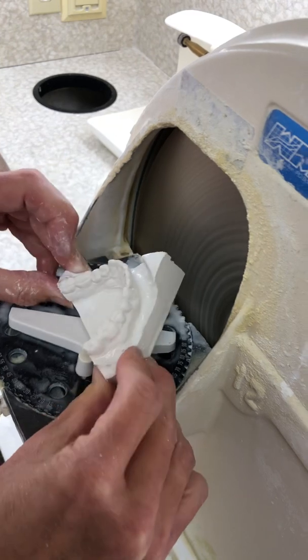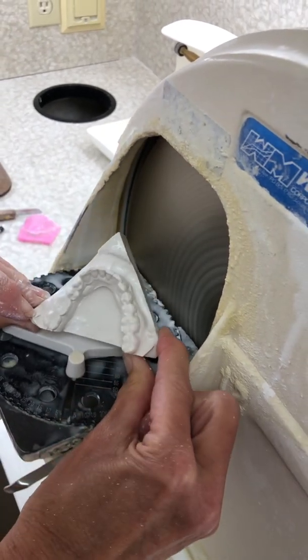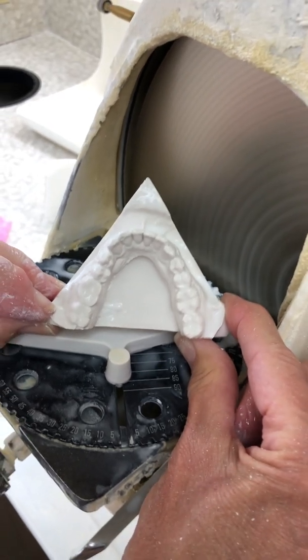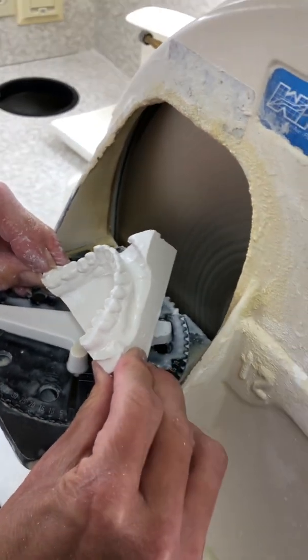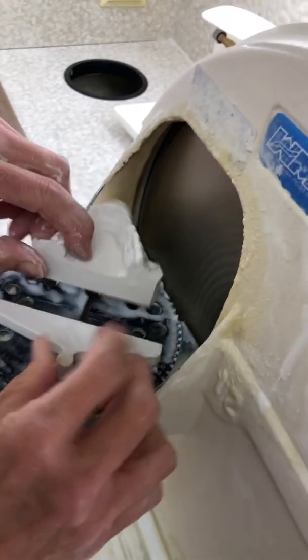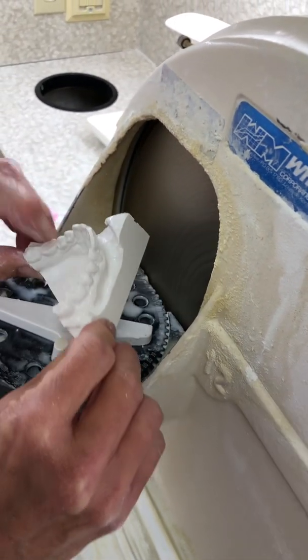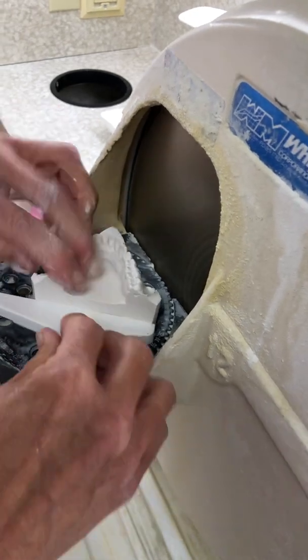Close, stop, and then basically take a look straight on and decide if there's something that one side is a little bit more than the other. And when I look at this, this side might be a little bit more, so we'll just touch it once more. That's pretty good. So next step, let's put it in our heels.